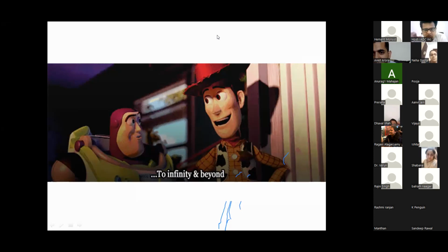Fine. So the next question is, how do we go ahead with a badly carious tooth when it is difficult to get the grip? Forceps में grip नहीं आता है ना, so how do we go about it? Many a time you are extracting 6, 5, or 4, but it is badly carious and you are not getting a fulcrum. In that scenario, my advice is to treat it as an impacted case. You need to work down the fulcrum from the bone to the tooth. The tooth is beneath the bone, and you cannot take a grip with the help of forceps.